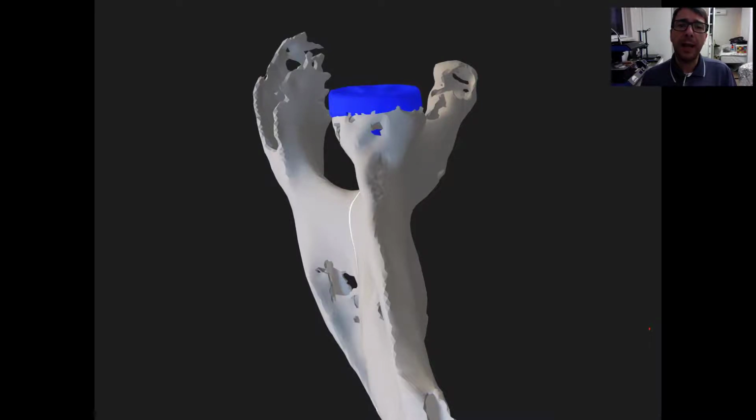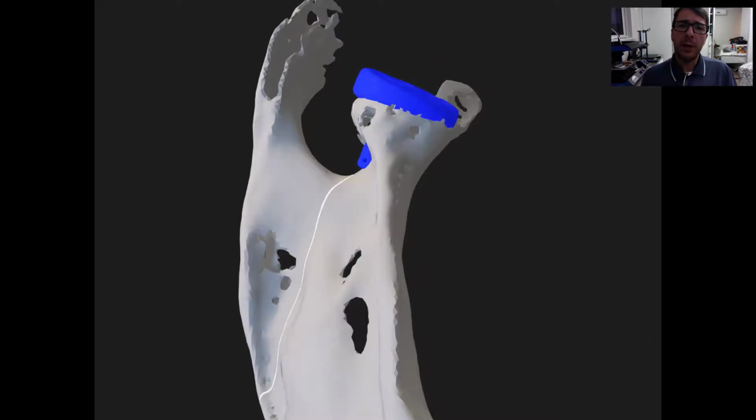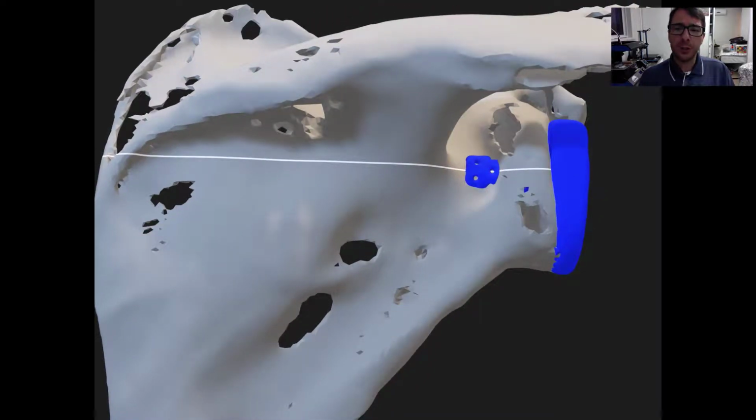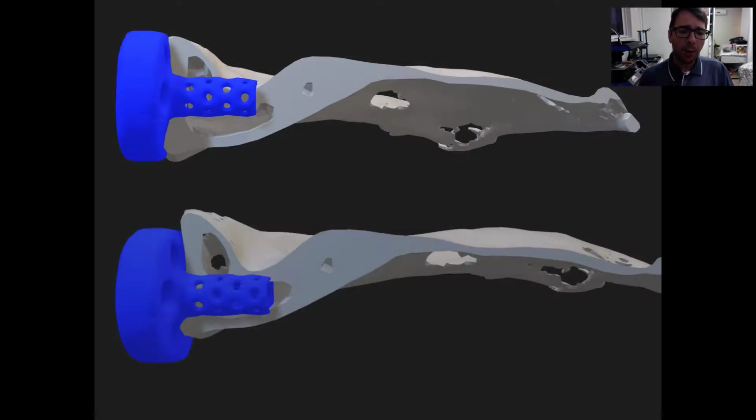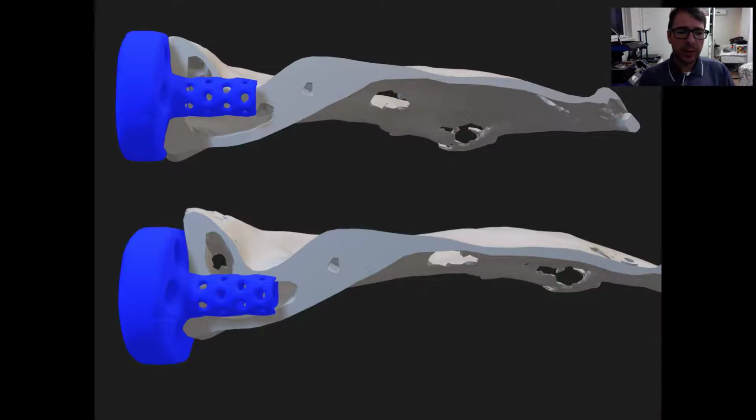Seeing this plan, we can see no problem, but when we turn to the posterior view, we see that this implant is not in the correct, most stable position, and is at risk of fracturing the posterior part of the glenoid. And sometimes we think that the middle is the correct position, but in this case, probably the correct position for this implant is a little bit anterior.